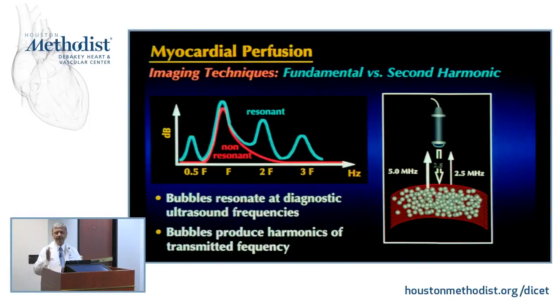Like, instead of ping, it will be ping. You'll hear the multiples, usually either the higher frequency or lower frequencies. Same thing happens to these little tiny microbubbles at a certain frequency. Interestingly enough, once they're stimulated, they'll emit the fundamental frequency in addition to multiples.